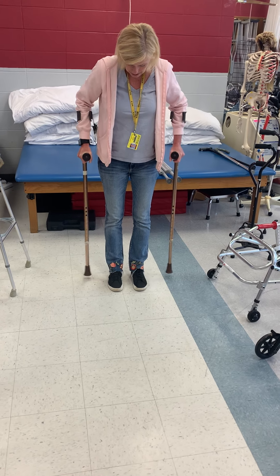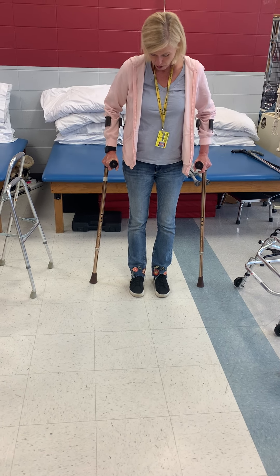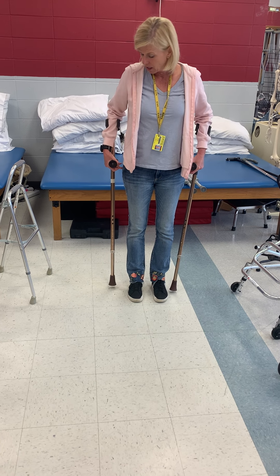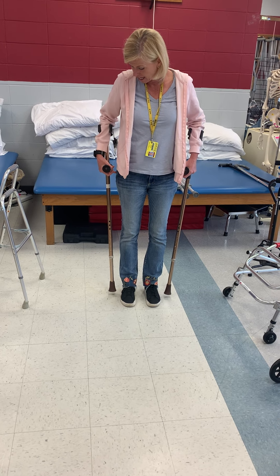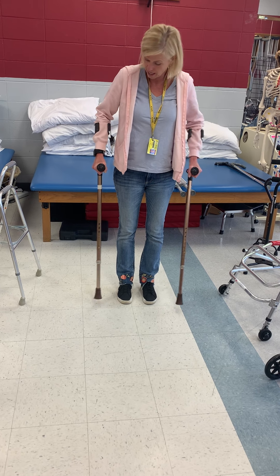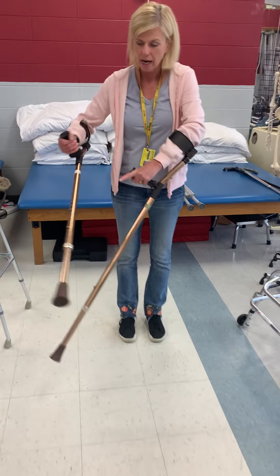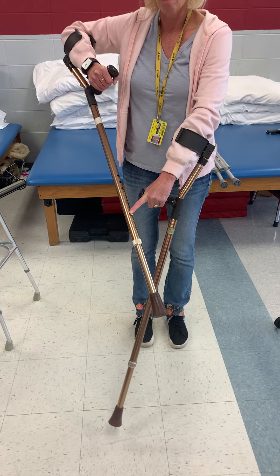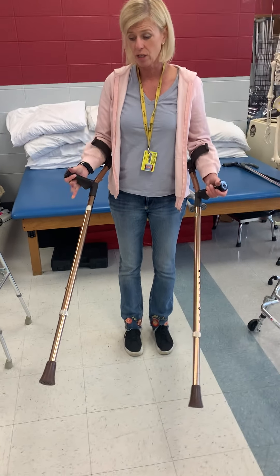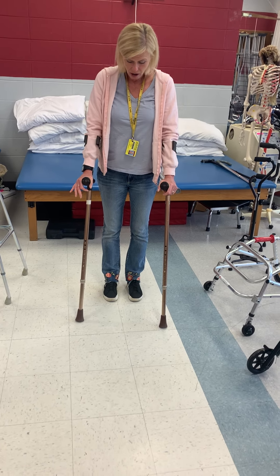It's the same positioning — four to six inches out to the side, and you want about 20 degrees of elbow flexion. I don't know why Lofstrand crutches aren't used more often. I would say the only thing is that with an axillary crutch it goes up a little higher, so it offers a little bit more stability than Lofstrand.